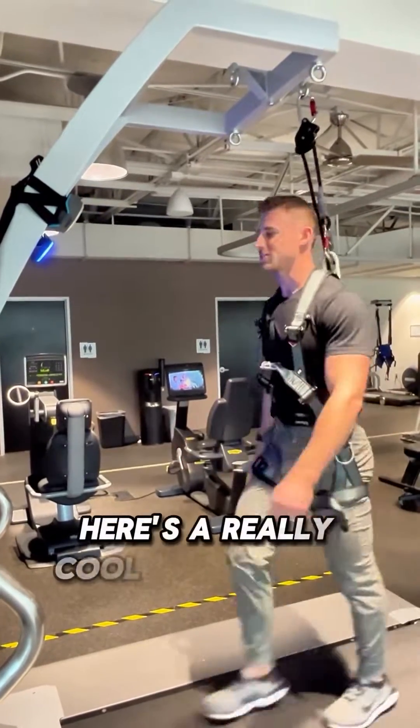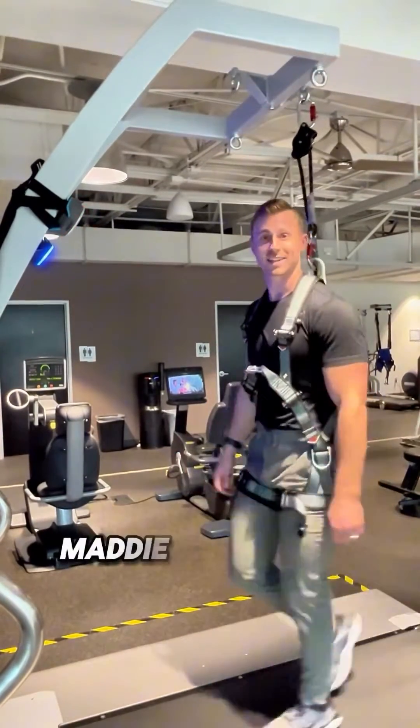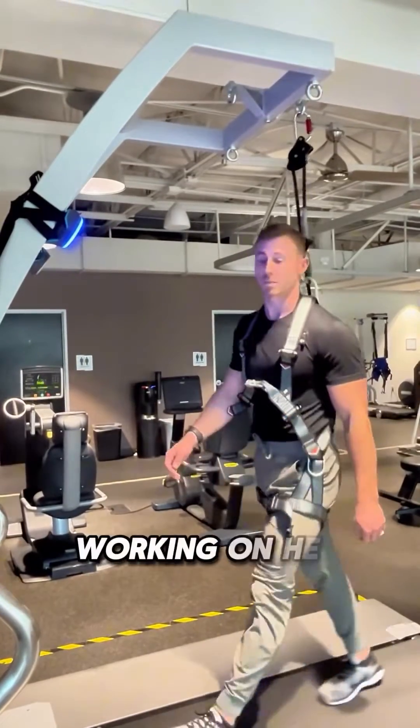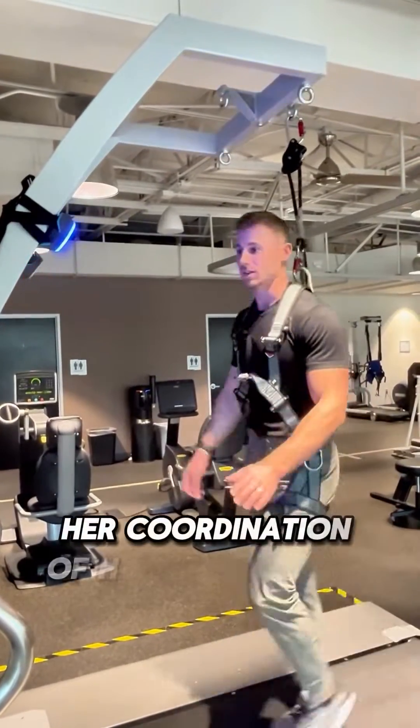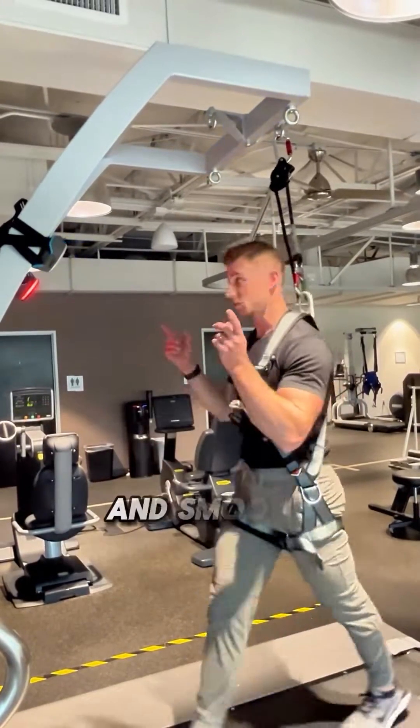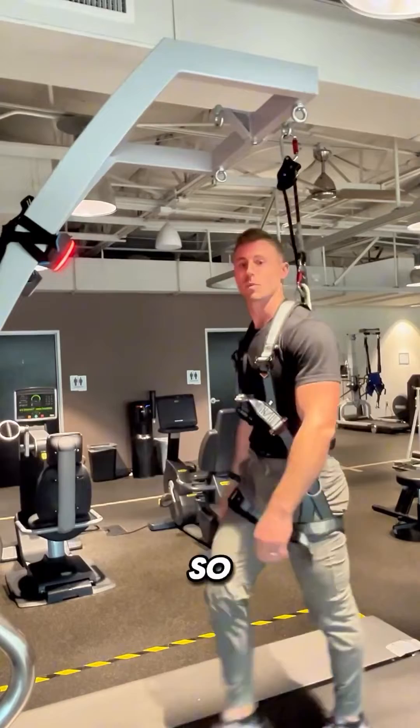Here's a really cool intervention that my student Maddie and I came up with today, working with a patient with MS on her balance reactions, her coordination of her left leg and left arm, as well as working on vision and smooth pursuits with ocular tracking.